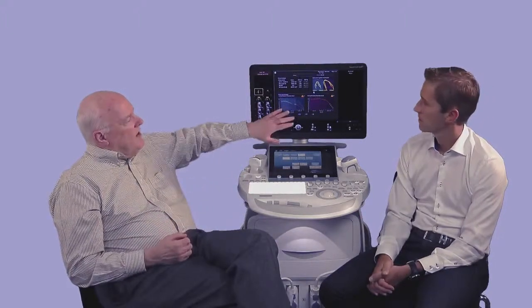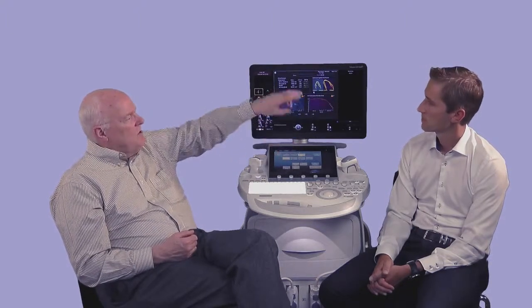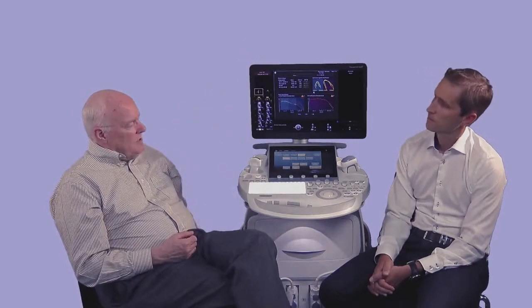And the beauty of this program is that when you print the report, there's a button that we push that gives you a CSV file of all the measurements in a column. So you can do an exam, print the file, and then take that file and you can add patient after patient in each column and create a data set that you can analyze. That's what I did.